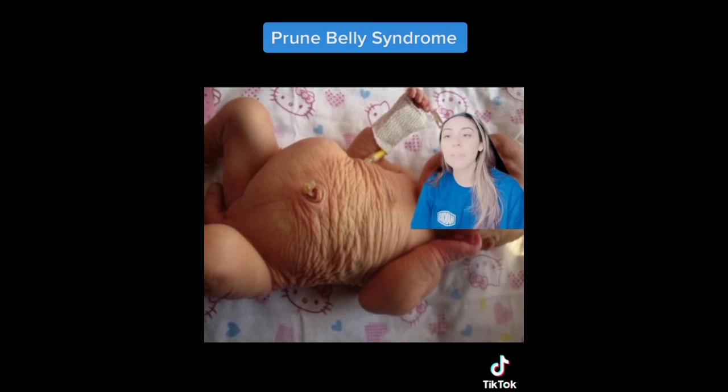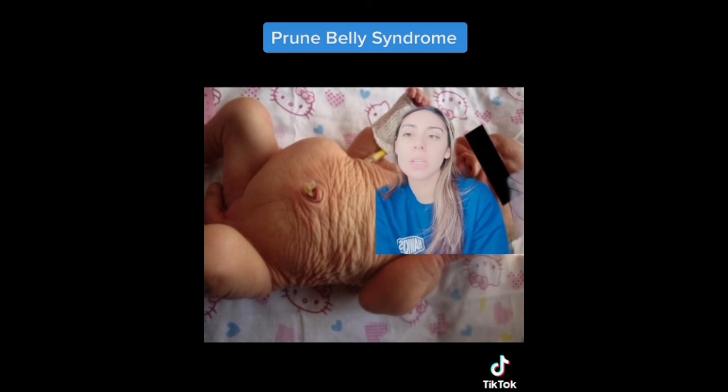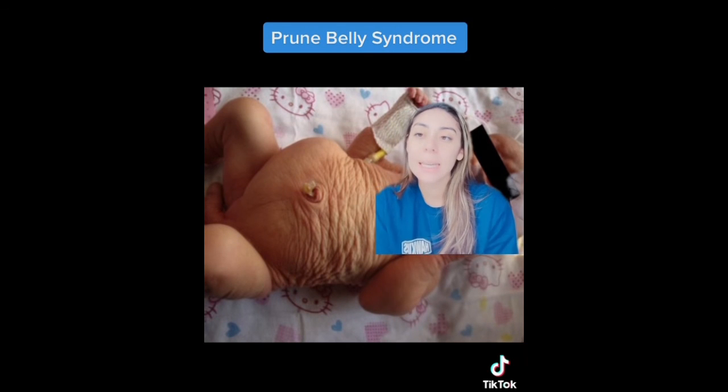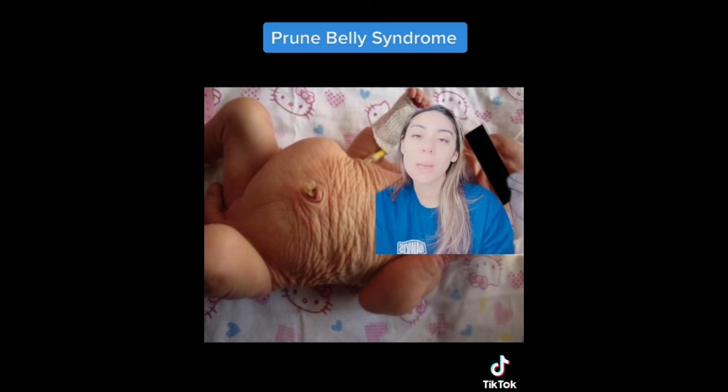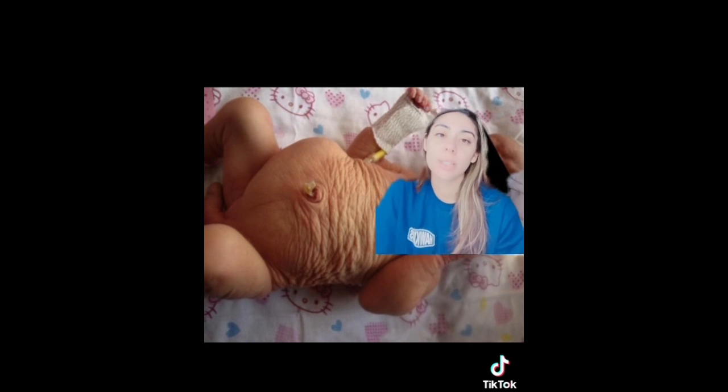Some of the sonographic features include the fact that the bladder is going to be anechoic, large, and thin-walled. The prostatic urethra is enlarged, with bilateral hydronephrosis and possible dysplasia. Ureters will be dilated or tortuous. The ureters may appear as multiple cystic lesions in a distended abdominal cavity. The last two will be oligohydramnios and a large abdominal circumference.